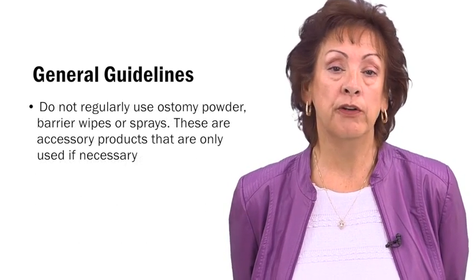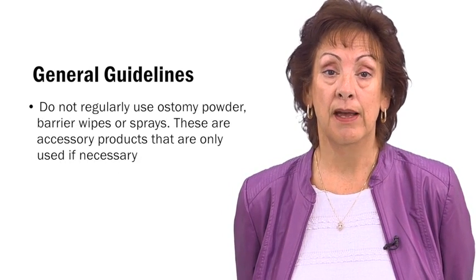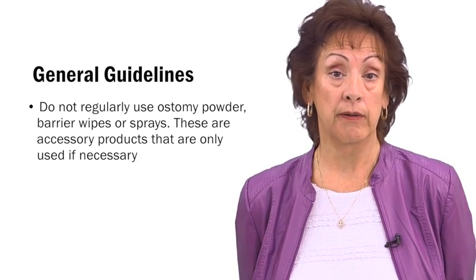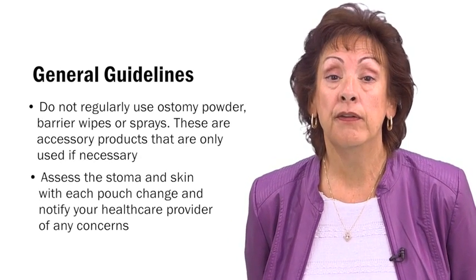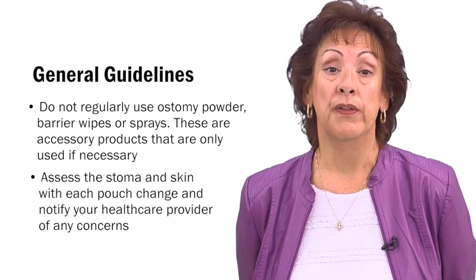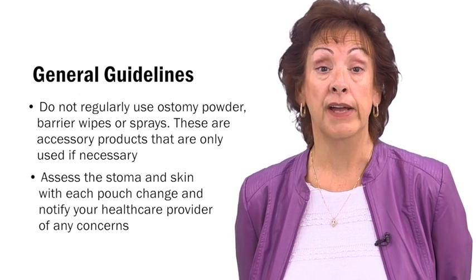Do not regularly use ostomy powder, barrier wipes, or sprays. These are accessory products that are only used if necessary. Assess the stoma and skin with each pouch change and notify your healthcare provider of any concerns.